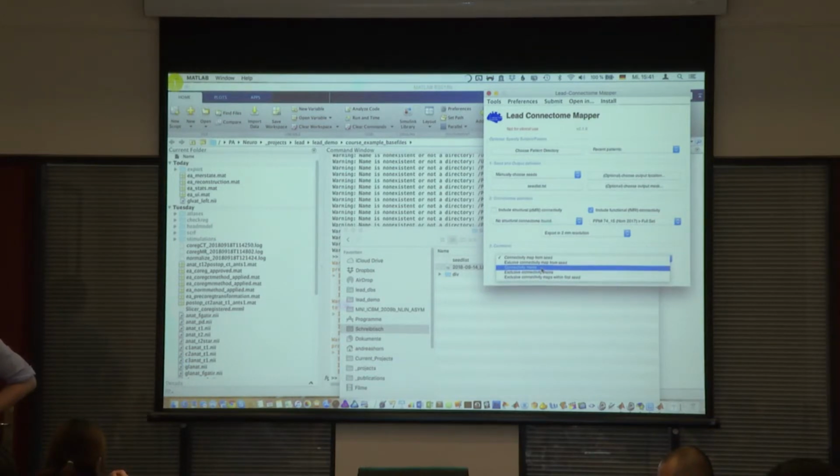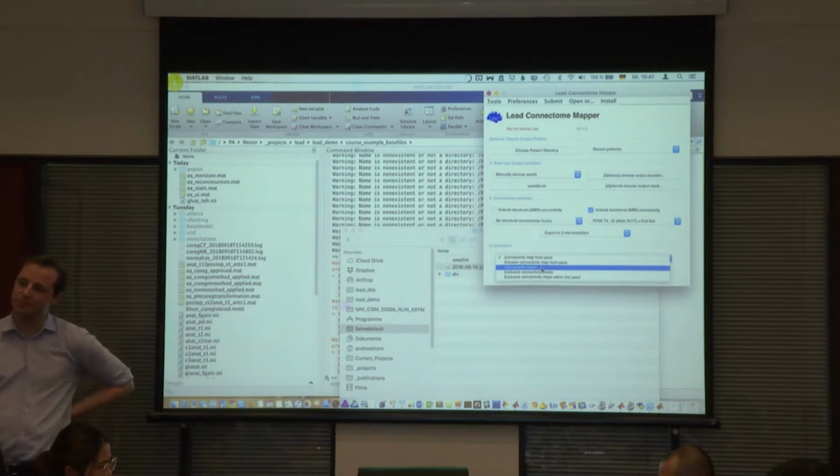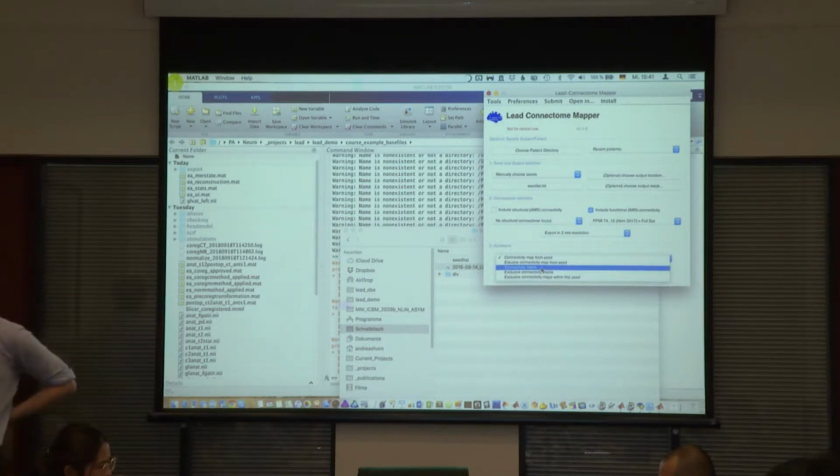And how variable is the connectivity strength in individual subjects compared to the normative data? Is that informative? You mean if I take VTA to SMA, and I do that, say, between STN and SMA, for an individual patient, how variable that is from patient to patient compared to the normative data? It doesn't provide any information. I think it's pretty variable, and it's so variable even if you scan the same patient twice.